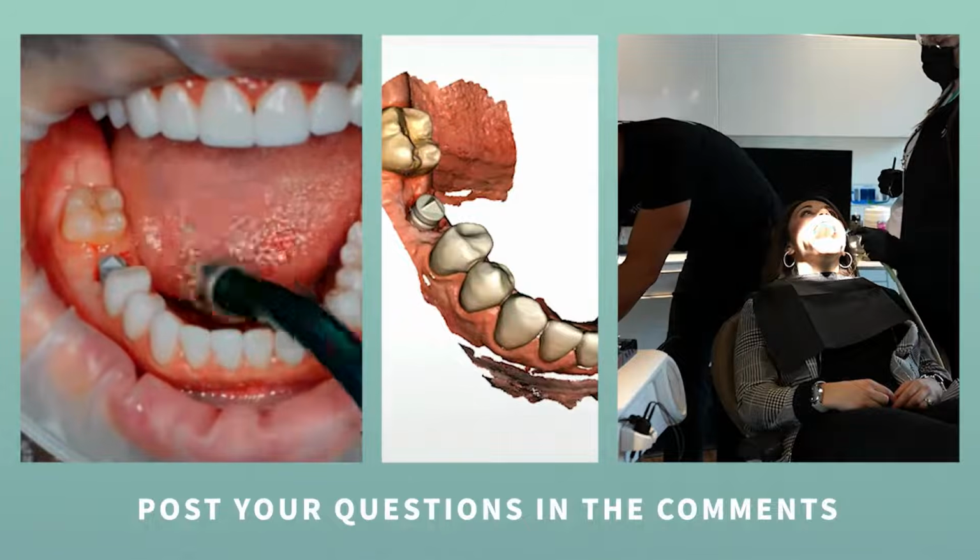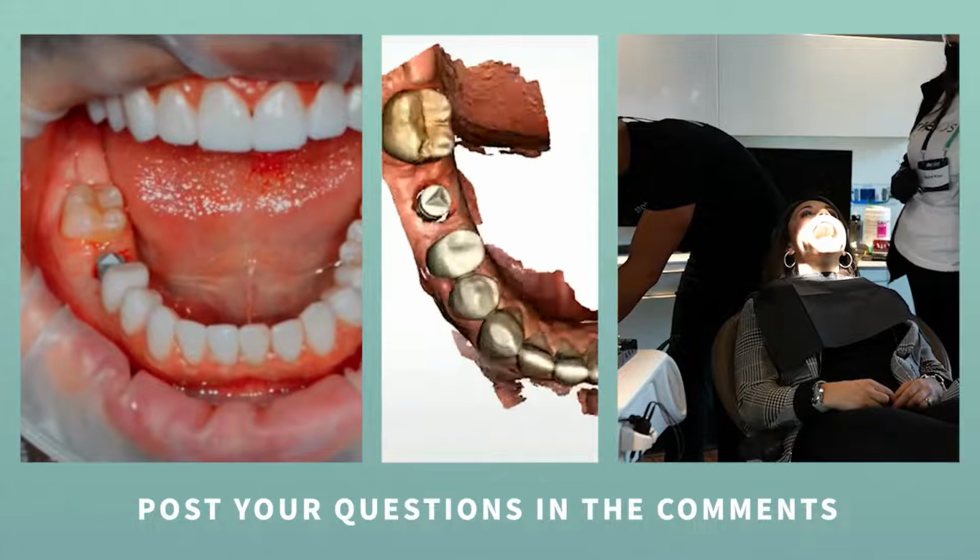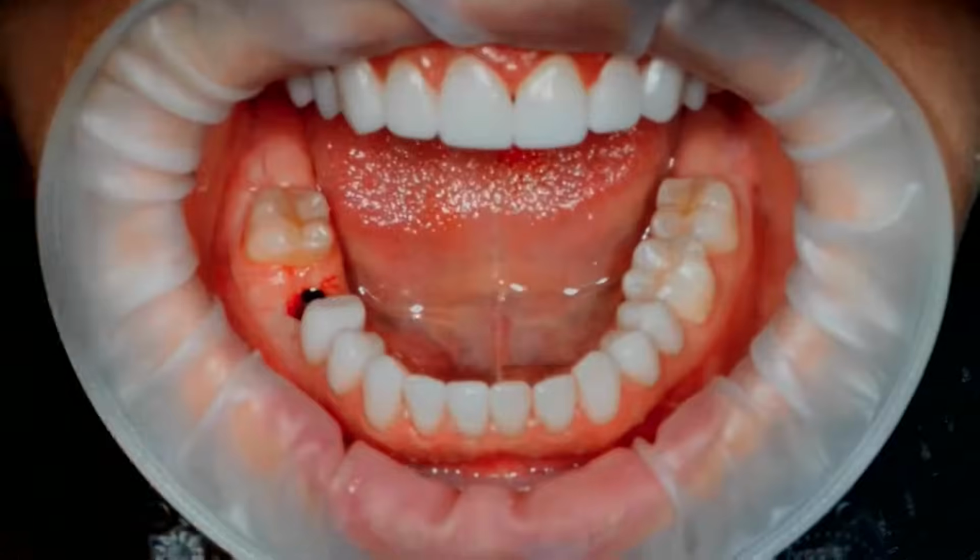Do that for the lower arch. We'll then do it with the upper arch. That way we're capturing both arches, and that way we can then get a bite and have the patient bite nicely and tight together.